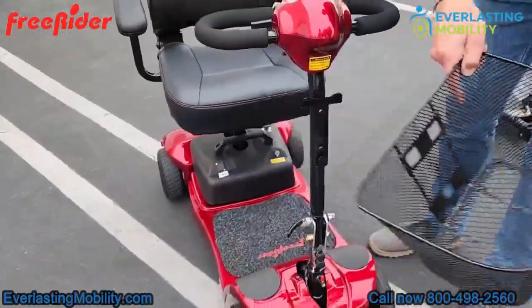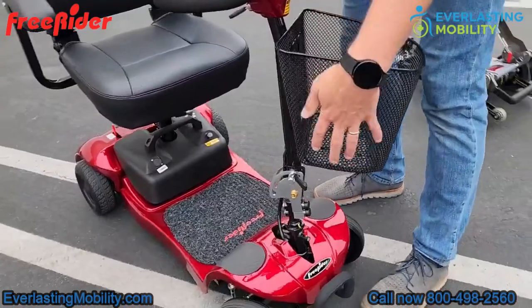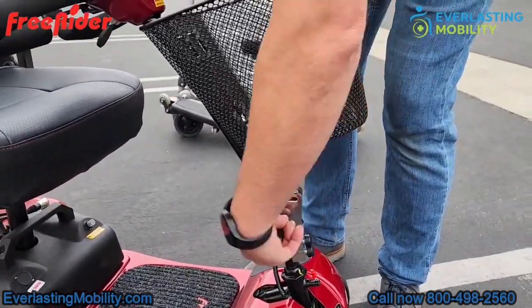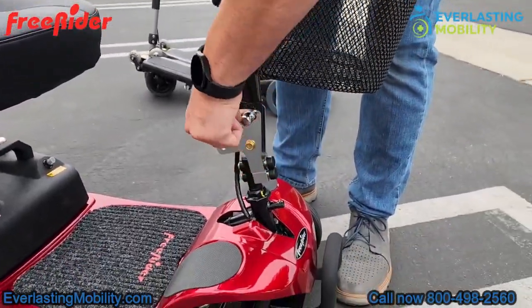There's also a nicely sized front basket that's easy to remove and reattach. The tiller is adjustable — move it toward or away from you and lock it into a comfortable position using the knob.